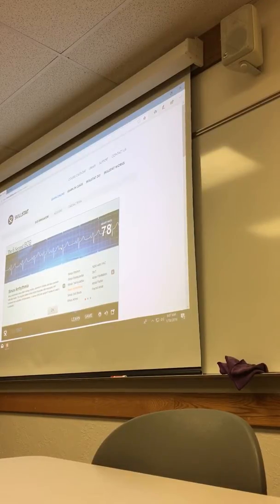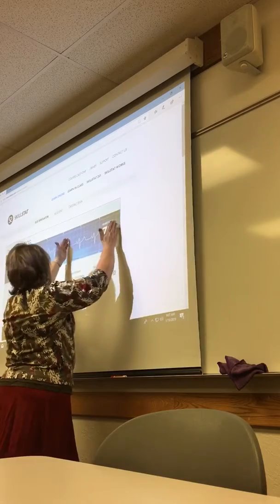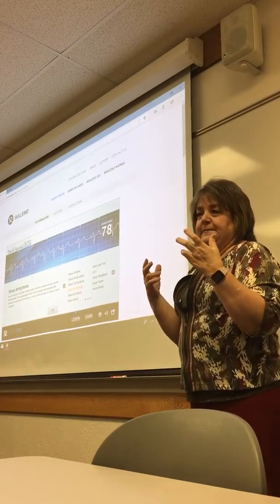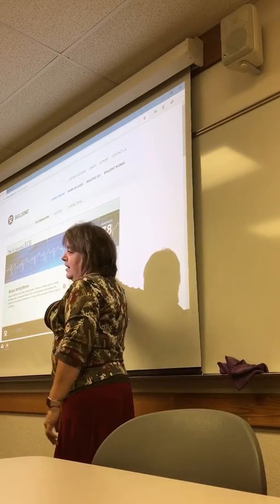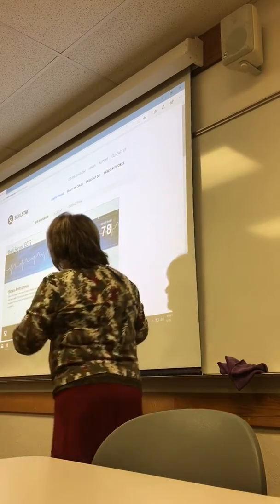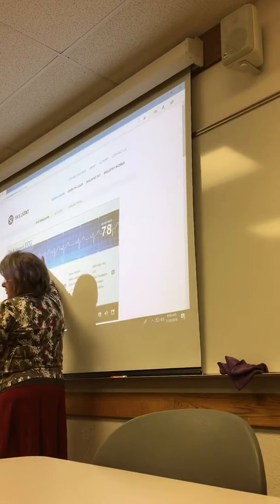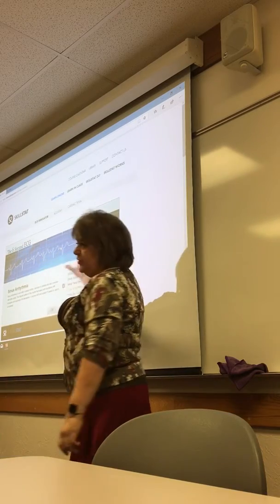Can you see that? This is breathing in, this is breathing out. So when somebody's in labor or in a lot of pain or about to pass out, sometimes we have them take a deep breath in and deep breath out. Why? We're trying to slow the heart rate. And this is just showing the slowing of the heart rate. So all this is faster, slower, faster, slower. So don't get caught up. Some of these, I don't think they give us the best rhythms. The notched T wave doesn't mean anything, and the great big T doesn't mean anything. We're just looking at it's faster and it's slower.